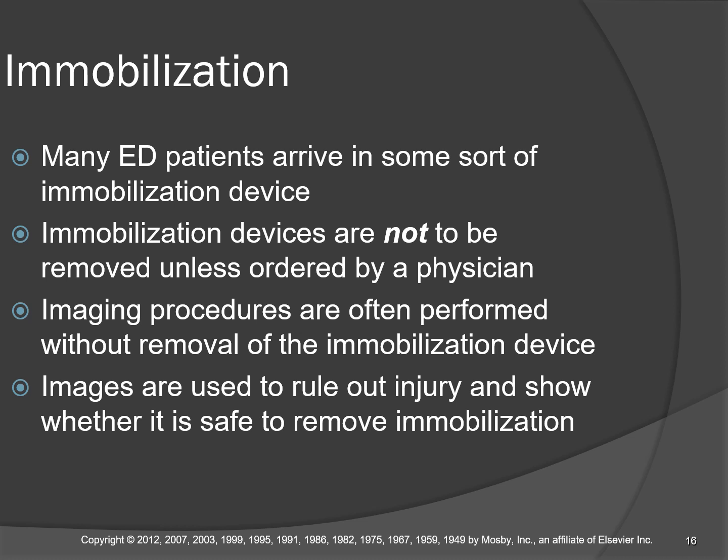I'd introduce myself. I'd ask them about the nature of their injury, take a little history, and then I would ask them about the immobilizer. Did they put that on themselves? Did the ambulance guys put that on? The EMT paramedic? How did their leg come to be immobilized? And typically the answer is the paramedic EMT put it on. So not always, but typically.